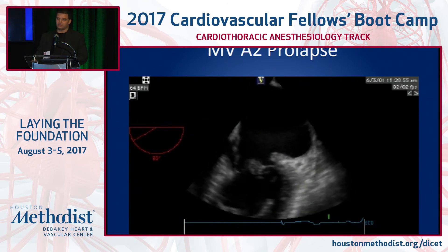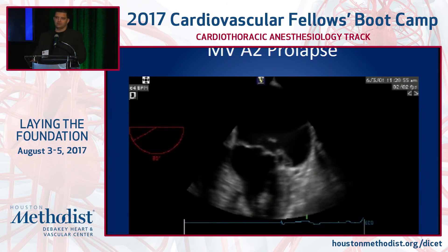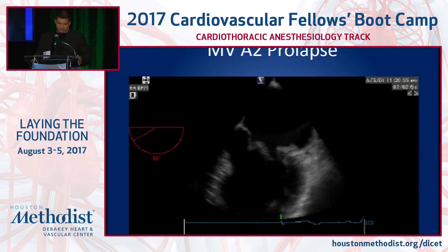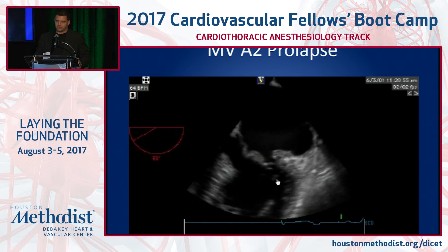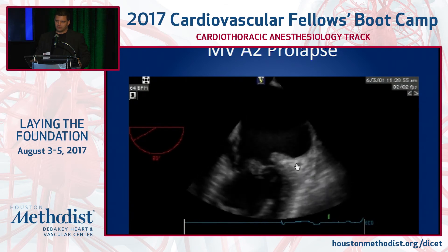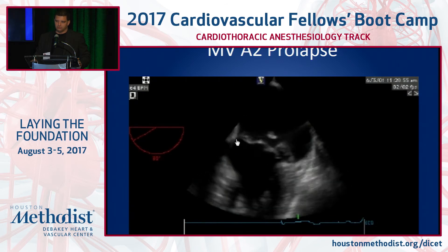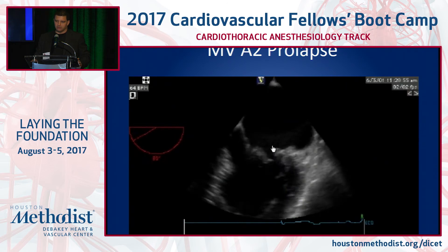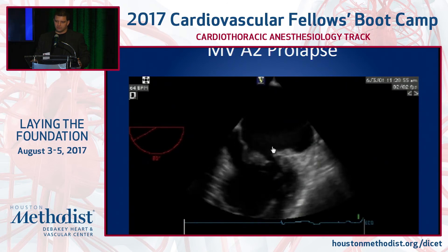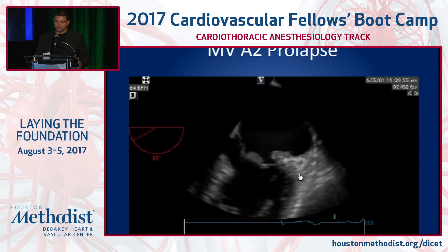As far as the mechanism of mitral regurgitation, this one is an A2 prolapse. It's a commissural view of the mitral valve — midesophageal commissural view. You're going to look at P1, A2, and P3 on this side. You can see a piece of the mitral valve coming up behind here. That's an A2 prolapse.